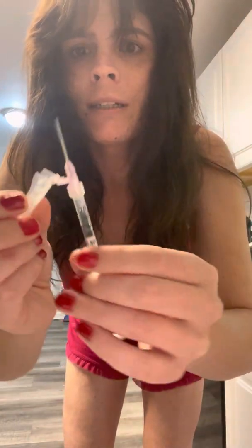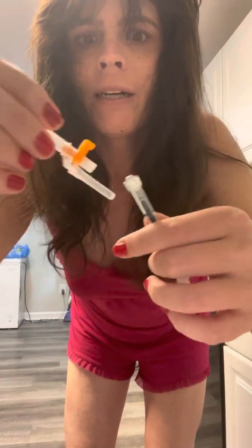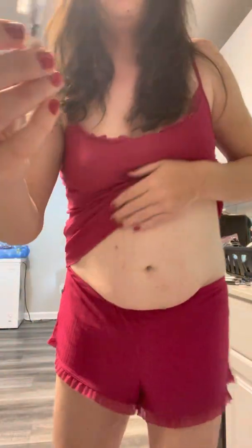I'm going to go ahead and carefully close this needle — it's got a safety lock so that you can't poke yourself. Now I'm going to screw on the needle that I use to inject myself; it's very thin. As I already applied some alcohol, I can reapply a little bit more just to keep the area sterile.